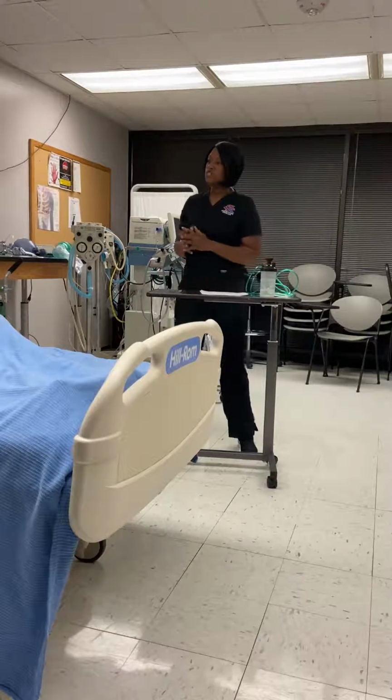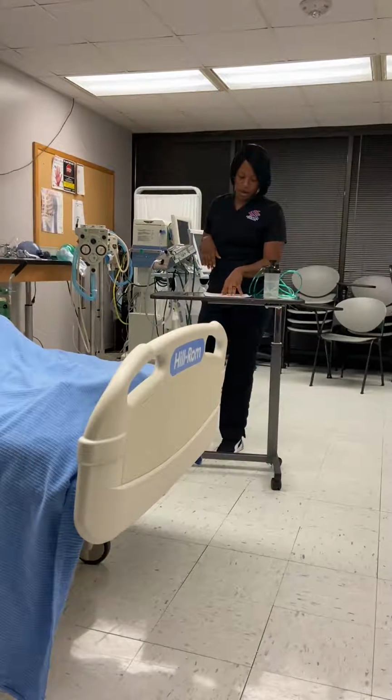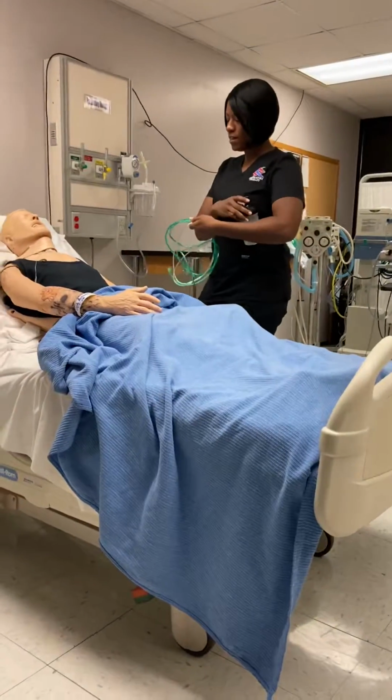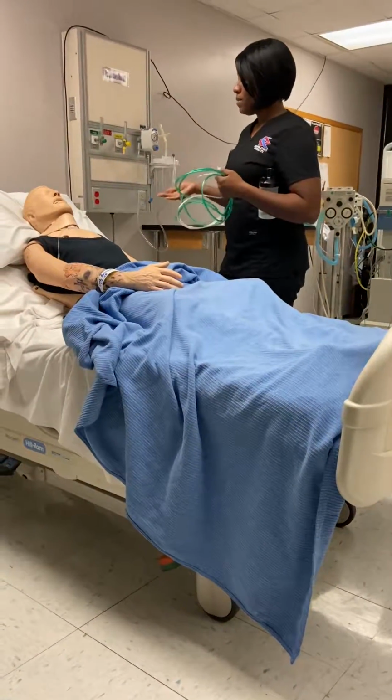I'm going to check for precautions, make sure that the patient's not on any kind of isolation. I'm going to knock on the door, wash my hands. Hello, I'm Camilla Respiratory. Is it okay if I get some vitals on you? The patient said yes. Could you please tell me your name and date of birth?